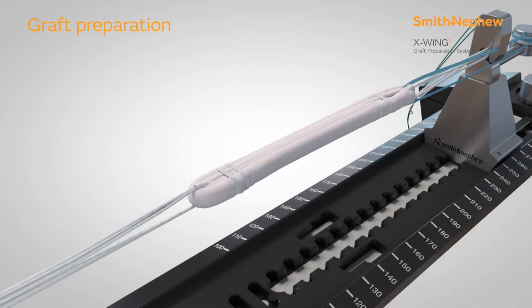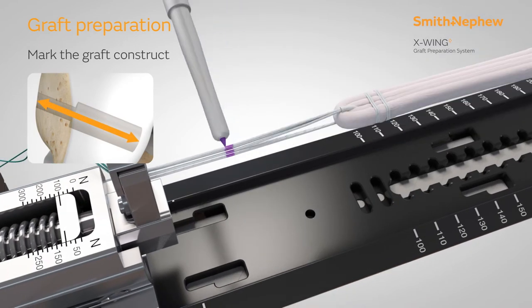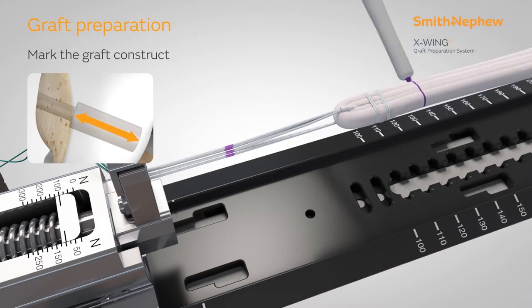The full femoral tunnel length can then be marked on the ultra button sutures to confirm button flip during later graft passage. Complete preparing the graft by marking the femoral socket length to confirm the graft position within the socket.